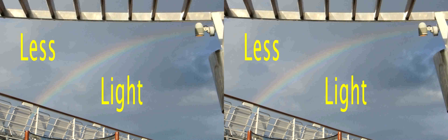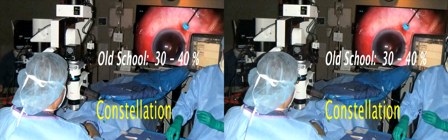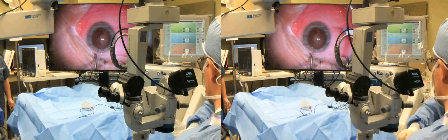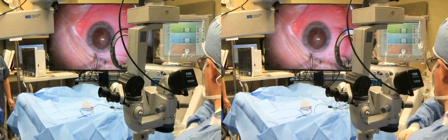Heads-up viewing systems have better low-light performance than the human eye, which allows the surgeon to turn down the light pipe. With Constellation, my light pipe is set from 30 to 40% when I operate old school, versus from 5 to 20% when I operate heads-up. With EVA, the light pipe goes from 100% down to 30 to 50%. Less phototoxicity risk is always a good thing.